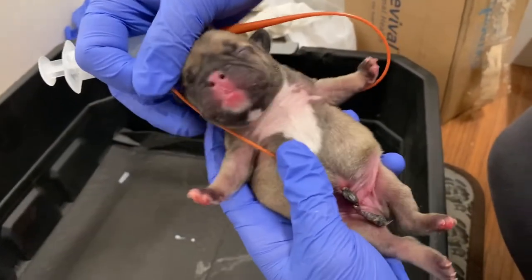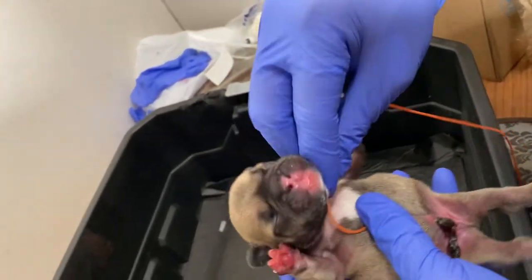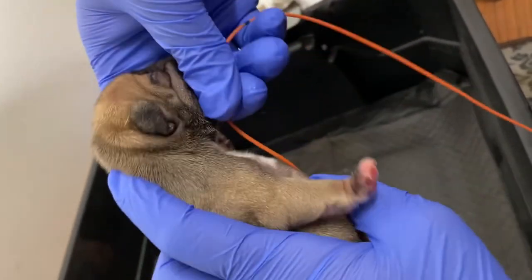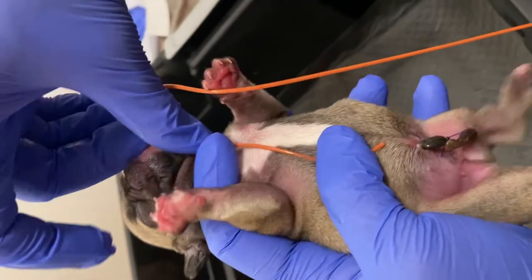When it comes to measuring the tube before feeding: you always want to measure it correctly. Start from the puppy's last rib — just pretend I'm a puppy — and make sure the tube is fully in contact with the body, no arching of the catheter at all. Full contact with the skin at all times so that the distance you mark is precise and correct.